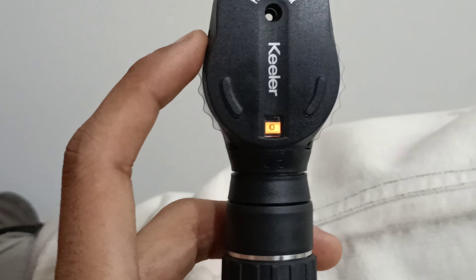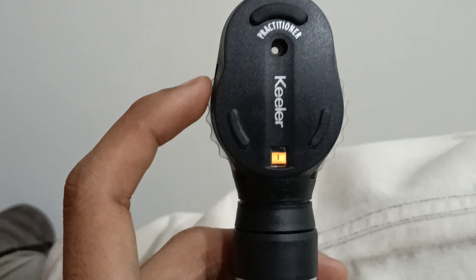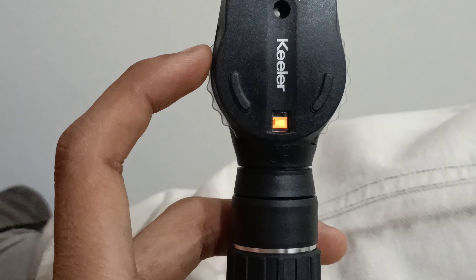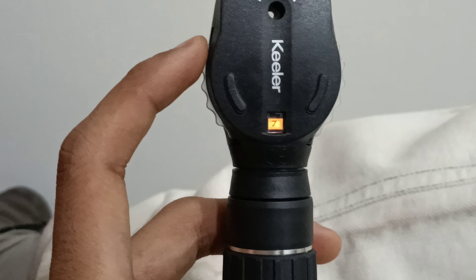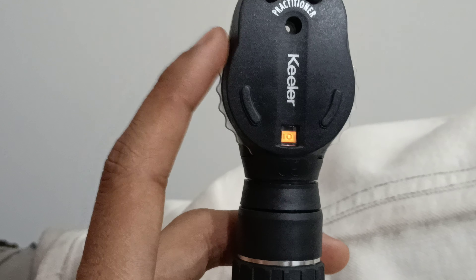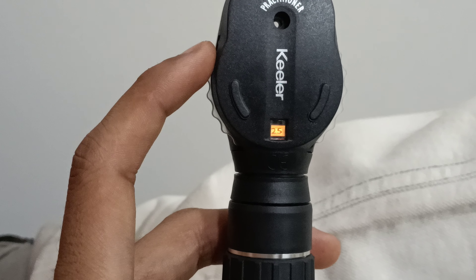Single-step diopter adjustment is available. Minus diopter values include: 0, minus 1, 2, 3, 4, 5, 6, 7, 8, 9, 10, 15, 20, and 25.